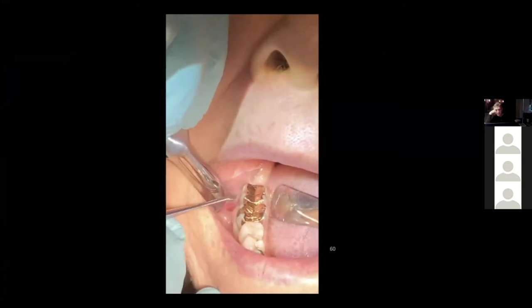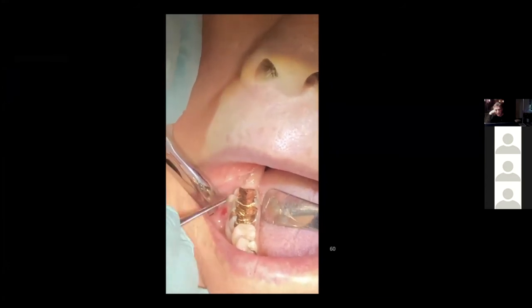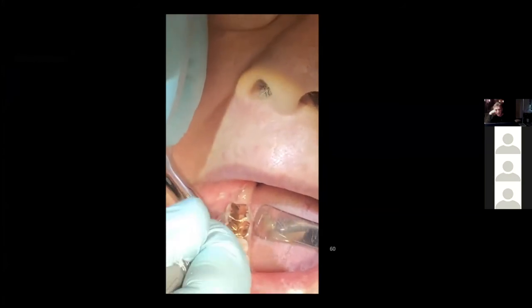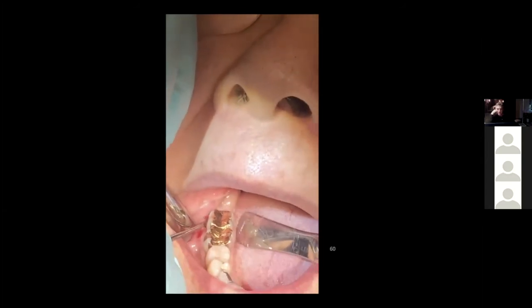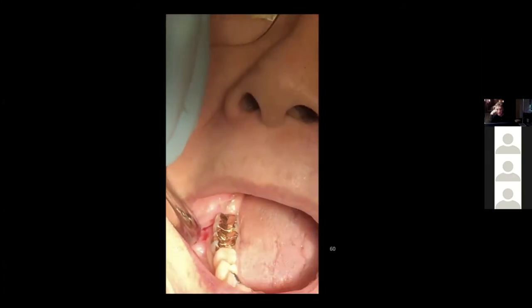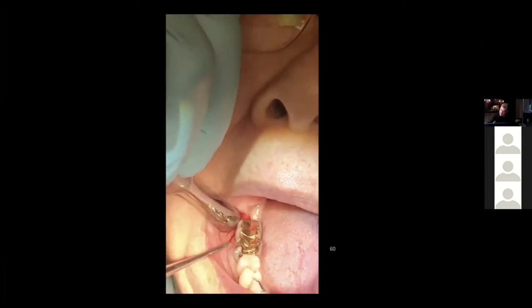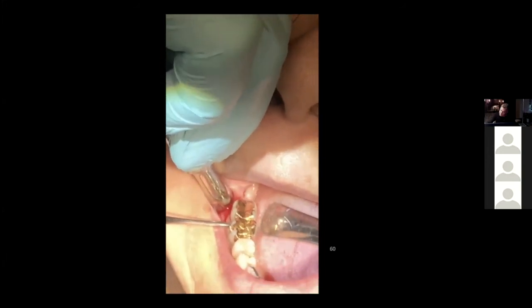So what you see me doing now is just severing fibers. You always want to do that no matter how easy the tooth may or may not be. This one's not periodontally involved. It just has a conical shaped root that should allow me to elevate it rather easily, as opposed to going through sectioning it and all that kind of protocol that I normally advocate.